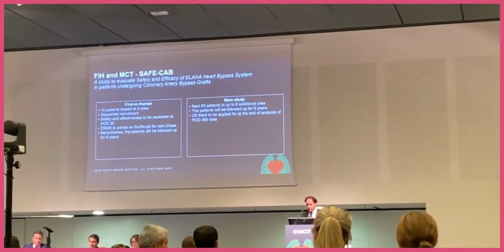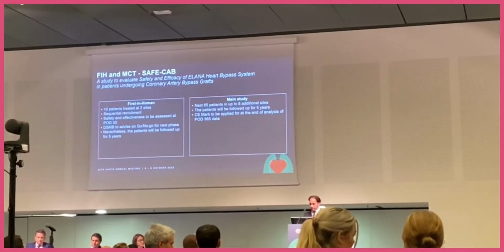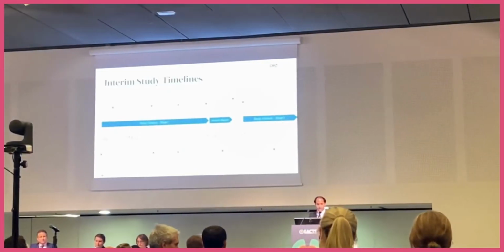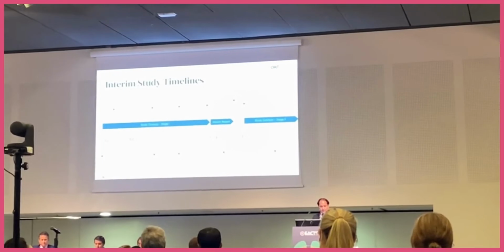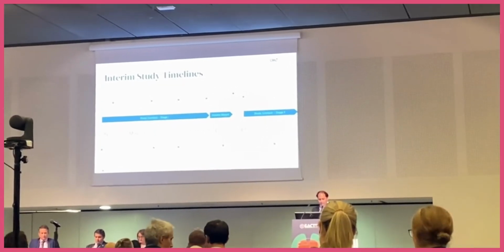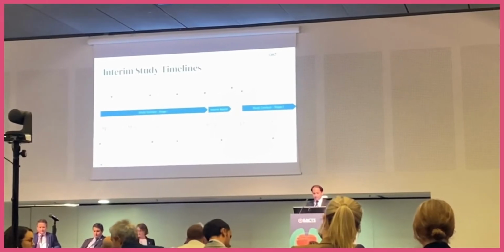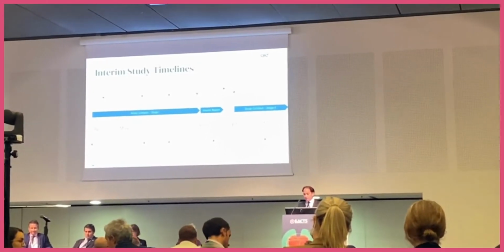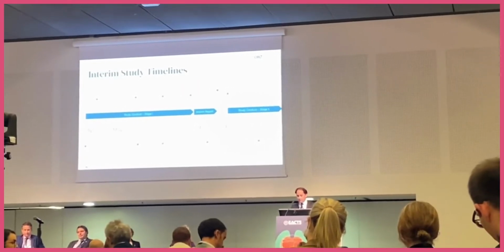Hopefully you will see a marker for the device. There's repeat angiography after 12 months. So this is the interim timeline for this year. The first patient entered the study on April 11th, and the last patient entered on June 15. Then the data set was closed. We waited 30 days for follow-up, and then a data safety monitoring board meeting and decision.